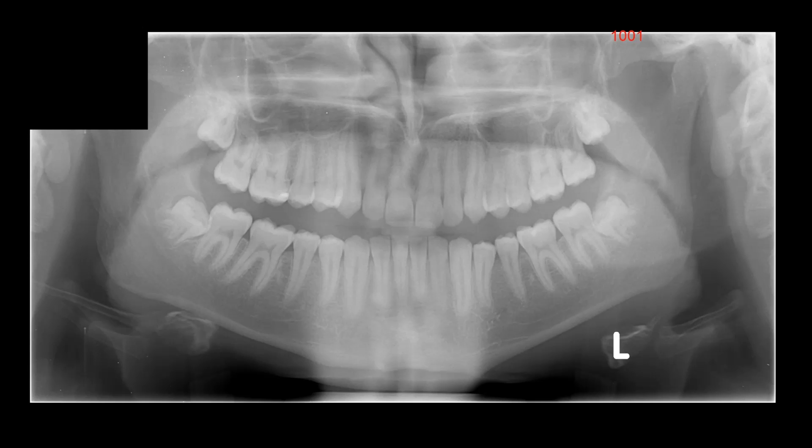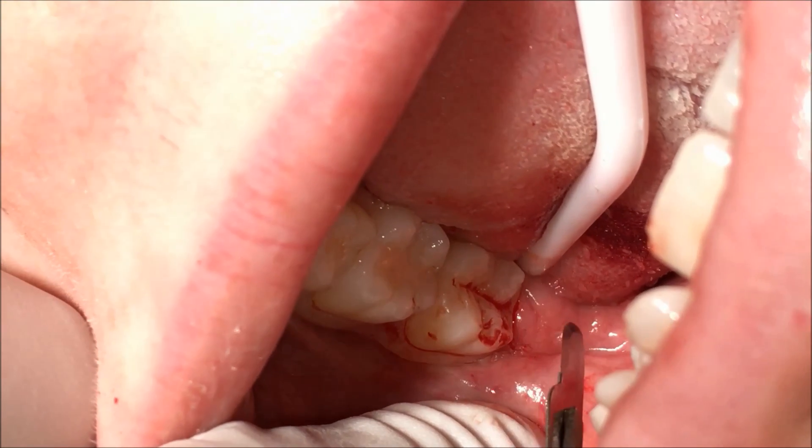Although the roots are immature, it's lingually inclined and that can make it quite difficult. I'm just going to be basically sectioning it into mesial and distal portions like this. We'll get started.